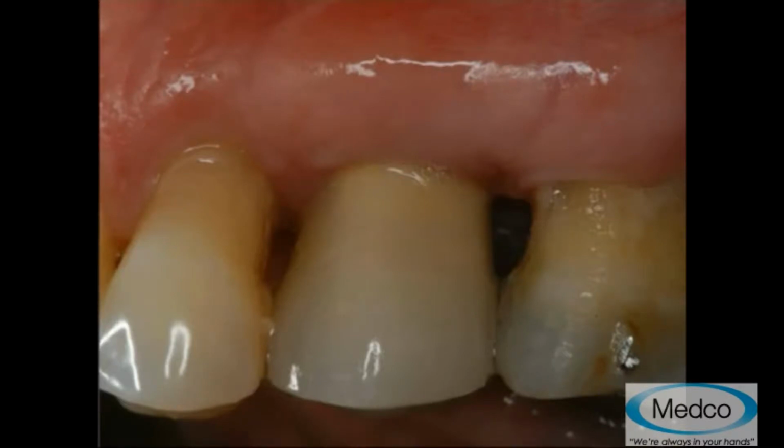And this was the path that took me down the road to using ISQ. At 4 weeks, I started to torque the abutment on, and being that it was a Morse taper, it started to engage at about 28, but the implant started spinning. I had a real dilemma because I can't get the abutment off at this point, and here's a patient who I don't want to necessarily provisionalize and hasn't read the manual. She's not going to be able to be provisionalized at 4 weeks. She was able to be provisionalized at 7 to 8 weeks, and the abutment finally placed.